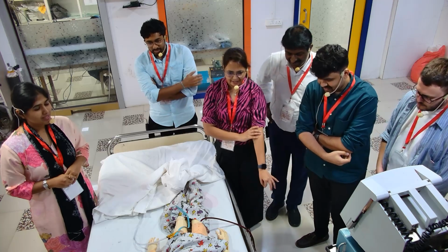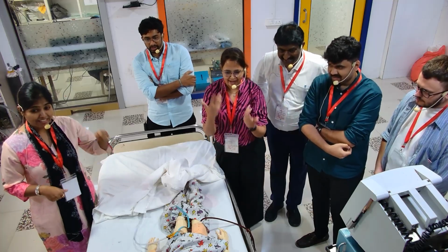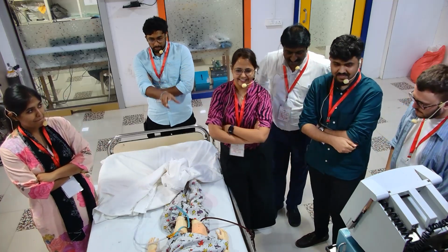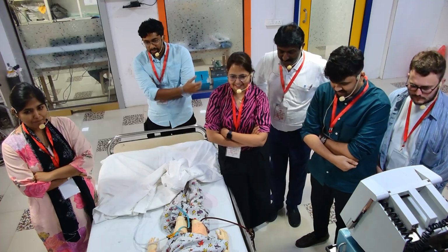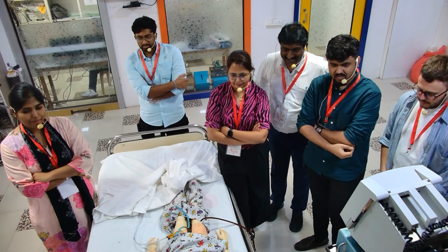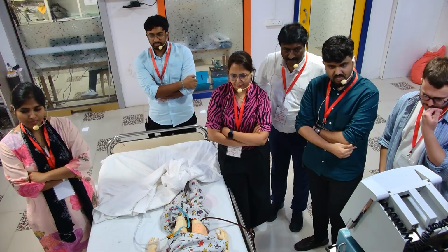We actually noticed and saw the cannula, but there was no kinking. It was stuck in between the railings, but there was no kinking. Yeah, actually it was stuck between, and this is what happens commonly. Okay, so anyway, what I want to say is that you diagnosed it.